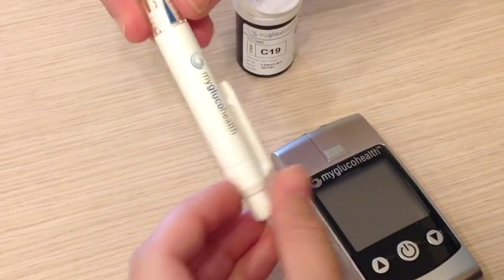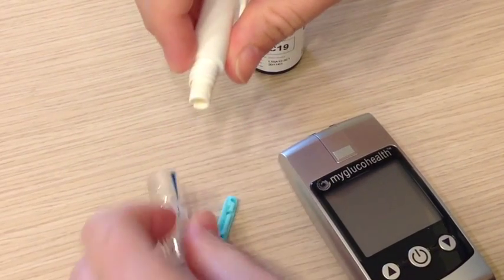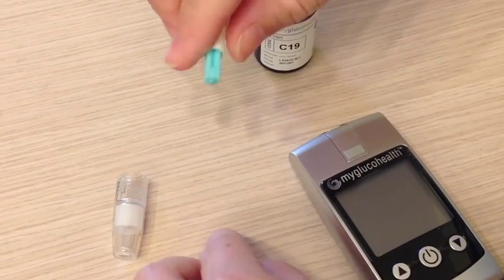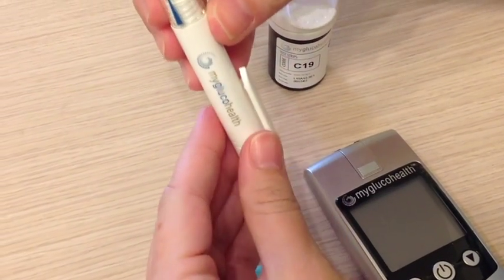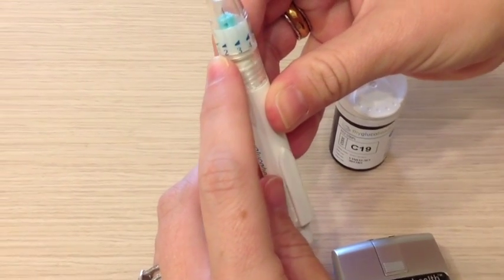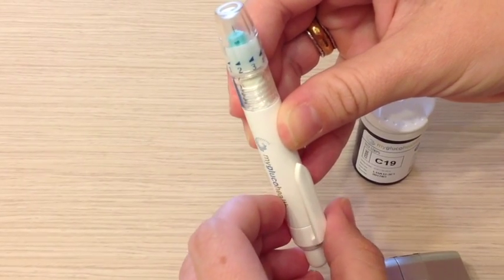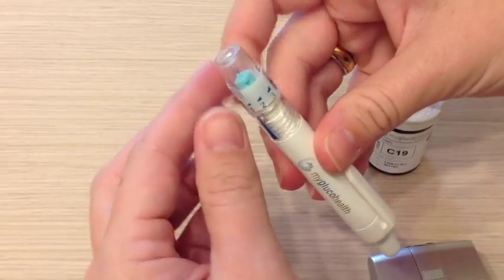First of all, this is the lancing device. This is a really nice one — you just screw the top off, put in your lancet, put the top off of that, and then screw this lid back on. Here are the different levels depending on how far down you want the lancet to go. For softer skin, use the lower levels. If you have calloused fingers, you're going to want to go to a 4 or a 5.